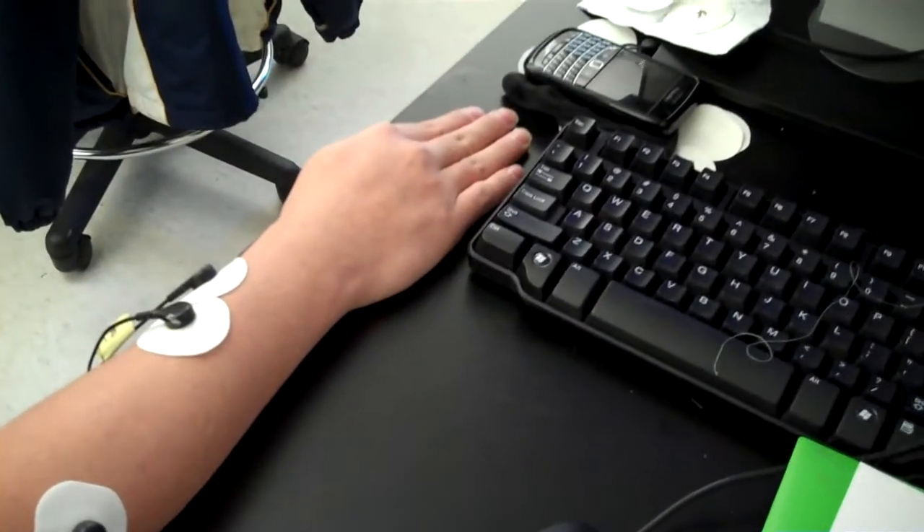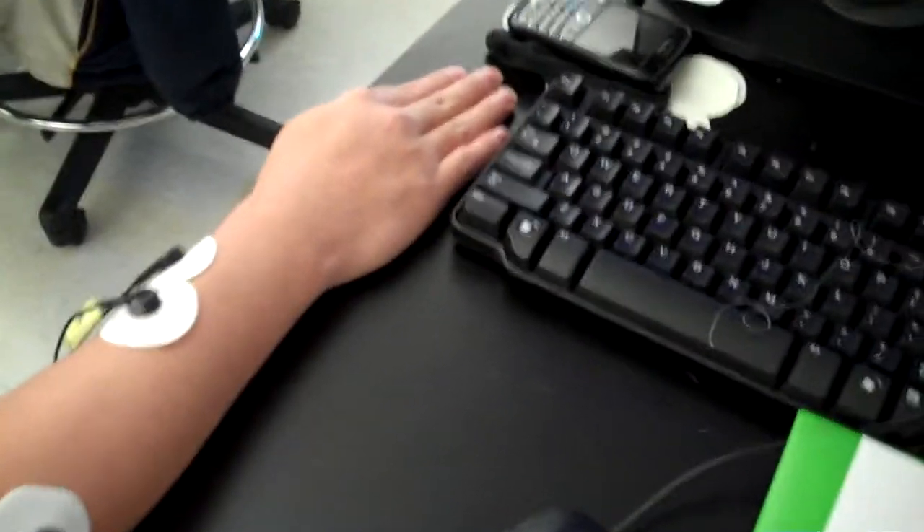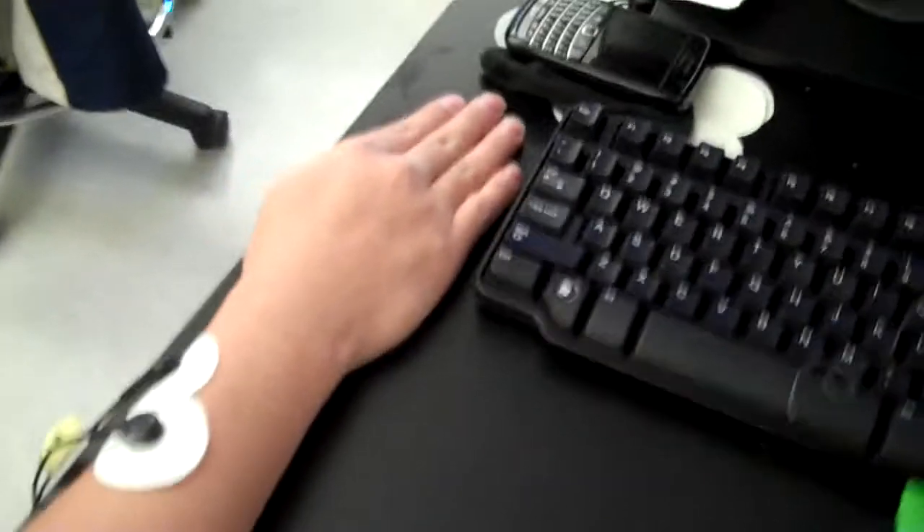Okay, so this is attempt two at our device. We were going to show you the individual movements and then show you hopefully a little better Tetris today.